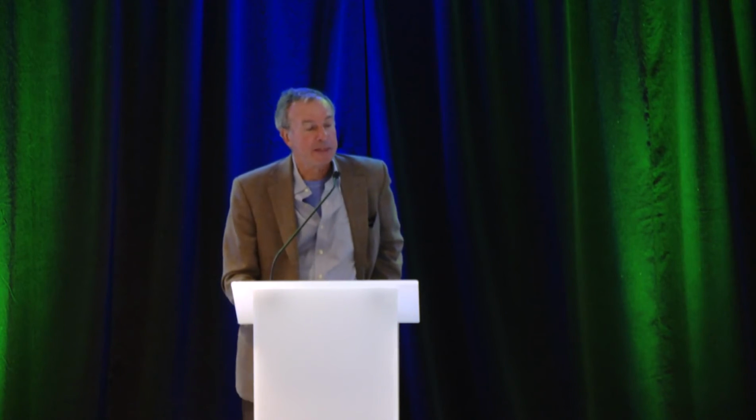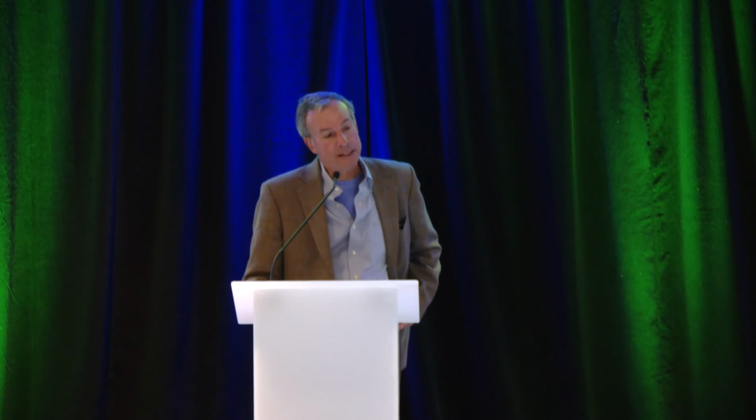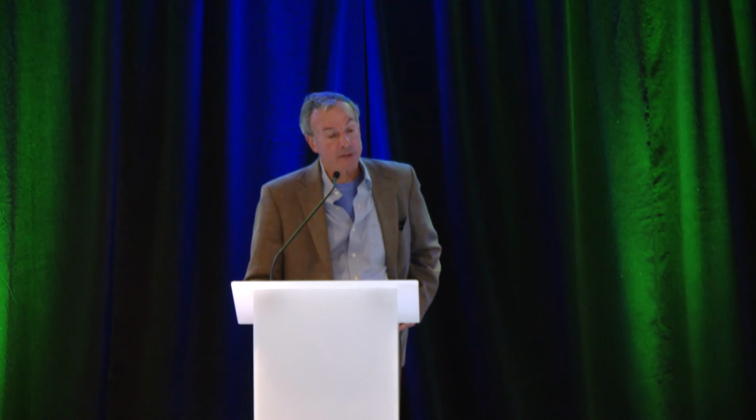And then we got into other devices. And a key device in the development of manometry was the sleeve, the Dent sleeve, named after John Dent, who invented it. And you see a graphic of the sleeve that I actually used to do the first realistic recordings of the upper esophageal sphincter back in 1987.